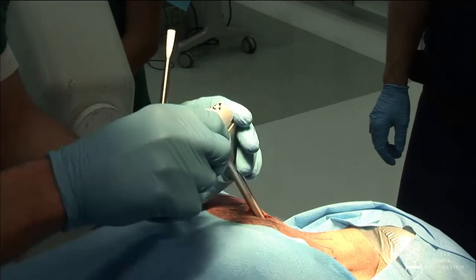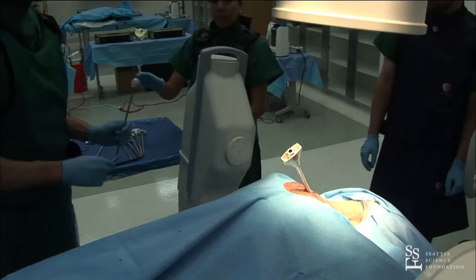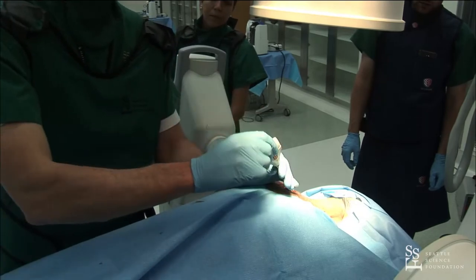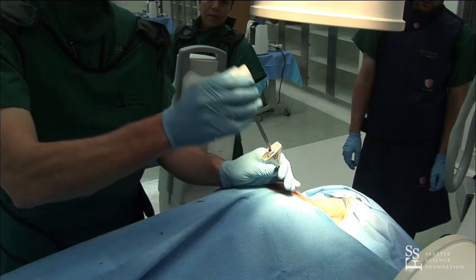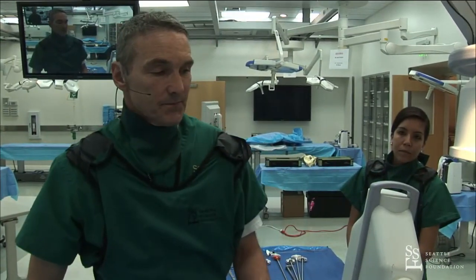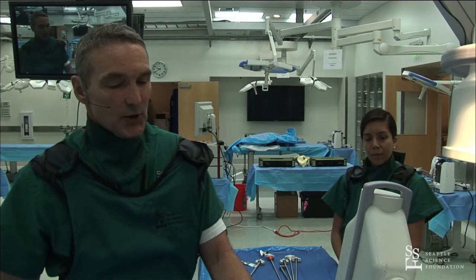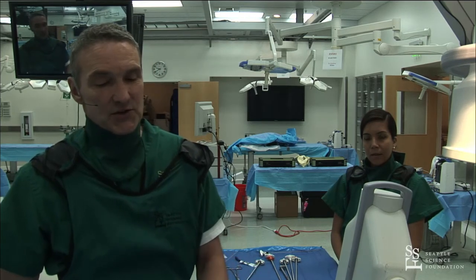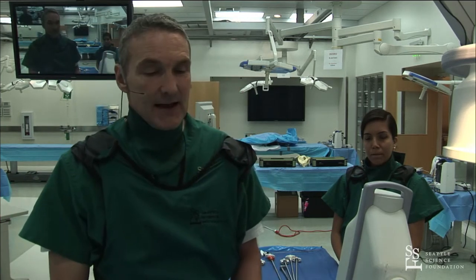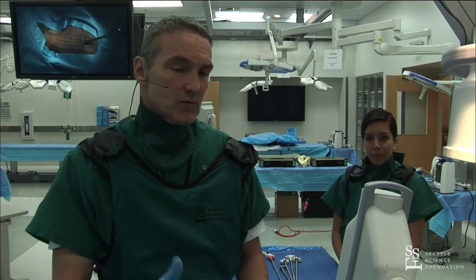Then what I do is put the bone graft in over the lateral mass. We put the bone graft in — we have a little pusher — and this impacts the bone graft over the lateral mass decortication. I've done a handful of these cases but I've never seen a cage back out and I've never used that screw. Have you ever seen a cage back out before? Yes — we have one case. There was a patient with Ehlers-Danlos who had a prosthetic disc. I don't think the patient was a very good candidate — they were very mobile. That's the only instance I know of the cage backing out. There are a few cases of pseudoarthrosis, but the cage remained in the joint.